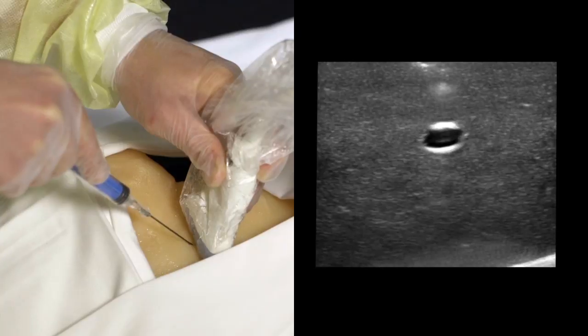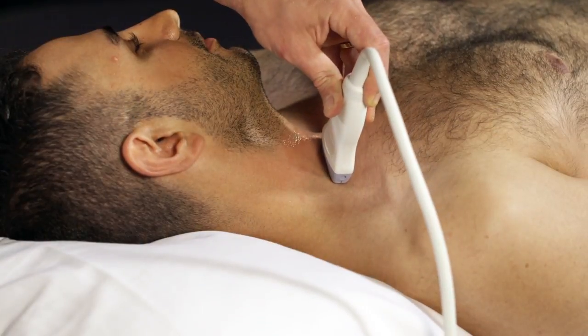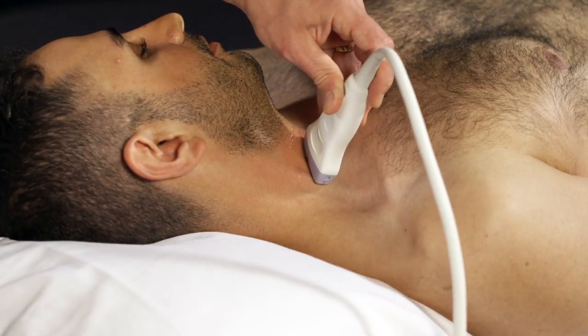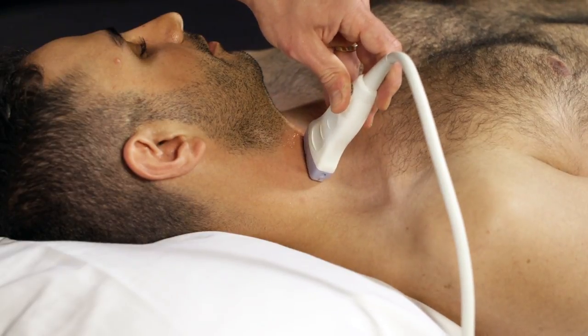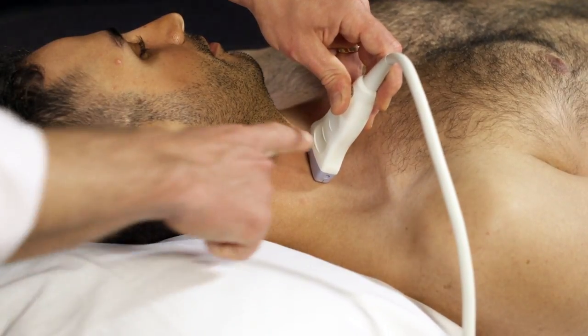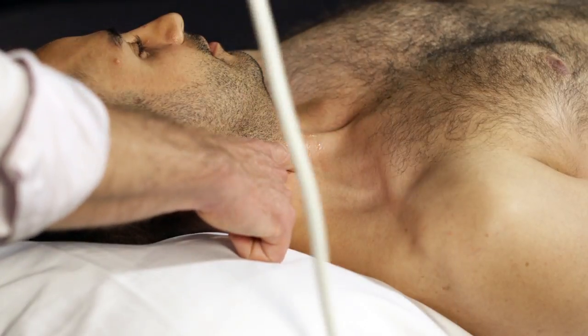If this is totally new to you and you feel uncomfortable using the probe and having a needle in your hand at the same time, start by using the ultrasound machine to landmark the vessel. Once you have marked the ideal insertion site, note the vein depth and put down the probe. Then proceed based on your visual memory of what you have seen.